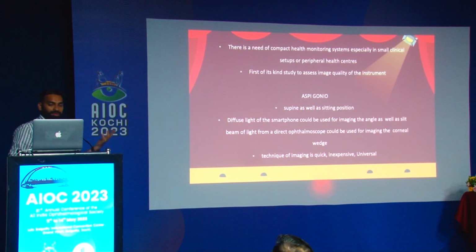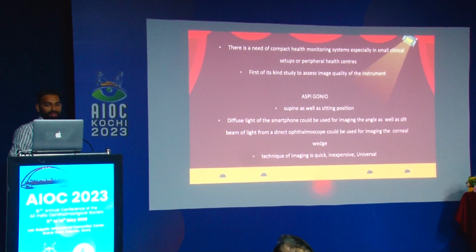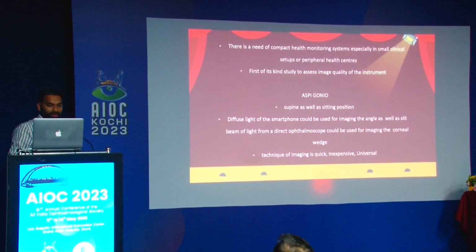There is a need for a compact health monitoring system, especially in small clinical setups such as peripheral health centers. And this was the first of its kind of study using this ASPI gonio.